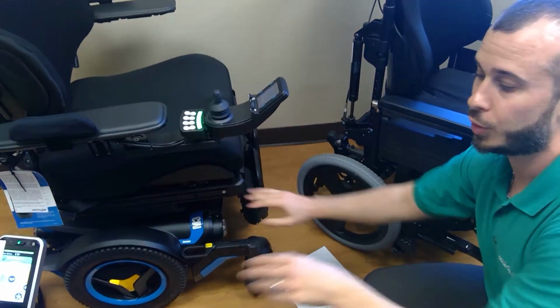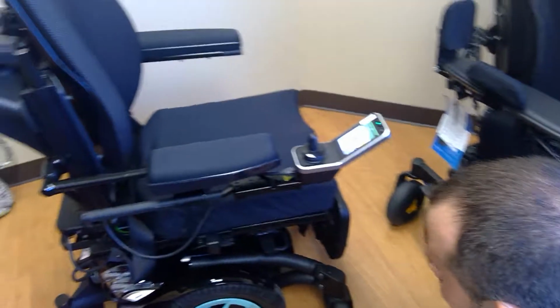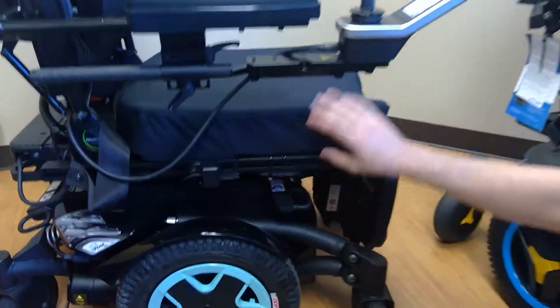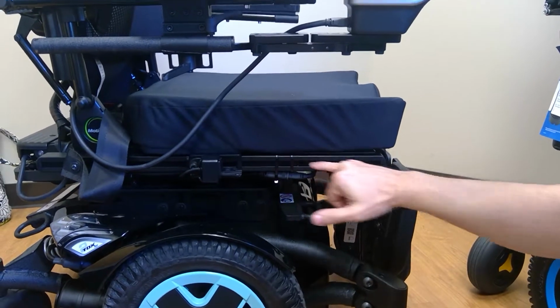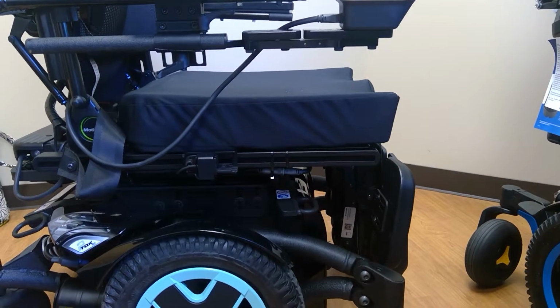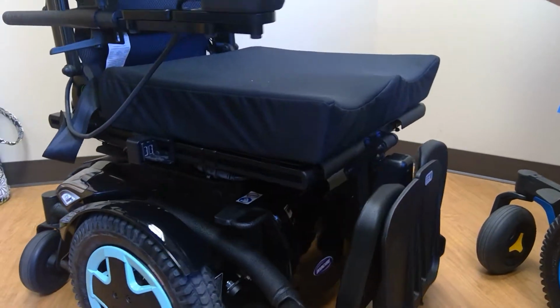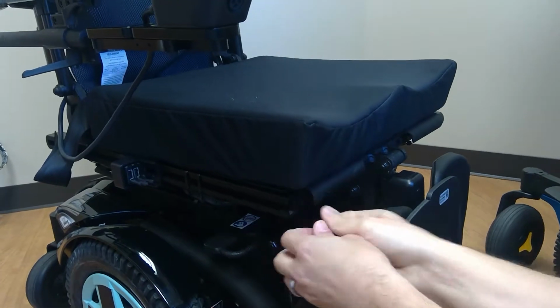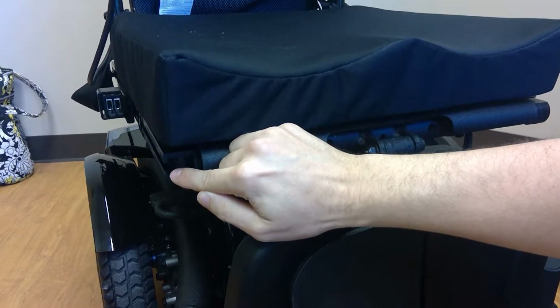So now we're going to move on to another type of channel, and this is an Invacare chair. And you'll notice that we're mounting to the same general location. Down here, right below the seat, you're going to see another channel. Now this one is just going to be a single track channel. So if we look at this from the side, one thing to keep in mind is that the most common channel is the one we're going to look at right now. And it's going to look like that, or kind of like a T cut channel.